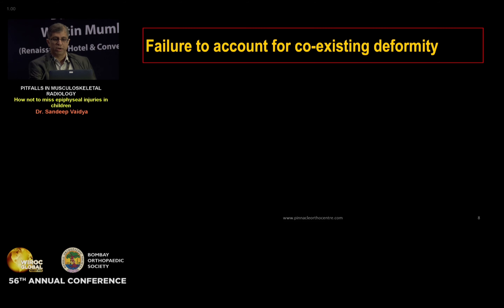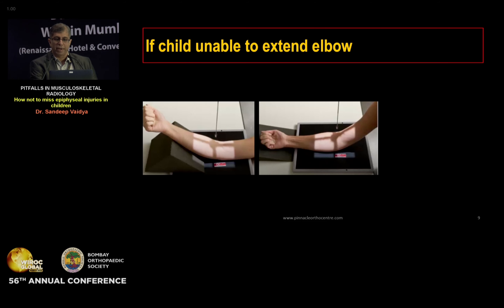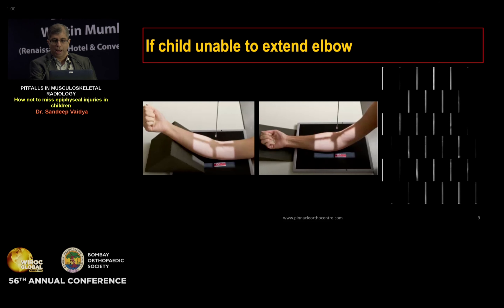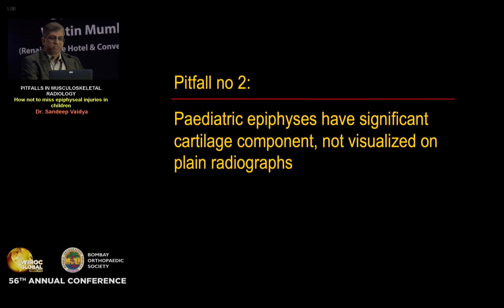On the internal oblique X-ray we realize the displacement is more than acceptable, so this fracture requires fixation. Sometimes we also fail to account for co-existing deformity. Following elbow trauma, the child is often unable to extend the elbow. An X-ray on a flexed elbow causes the capitellum to overlap the distal humeral metaphysis, which can be misinterpreted as a fracture of the lateral condyle. The solution is to obtain two separate views. Rule number one: always obtain optimal radiographic views and special views in select situations.